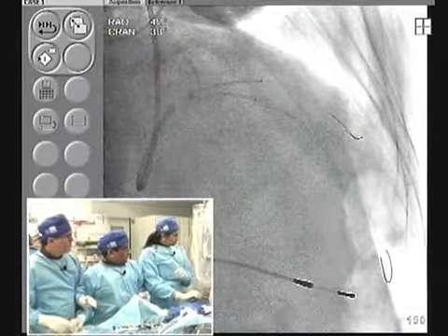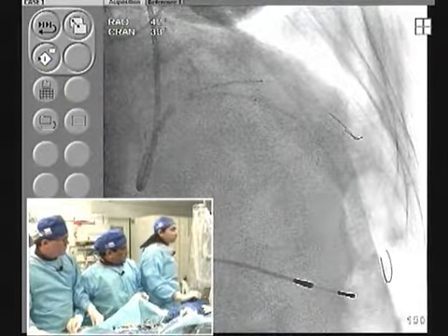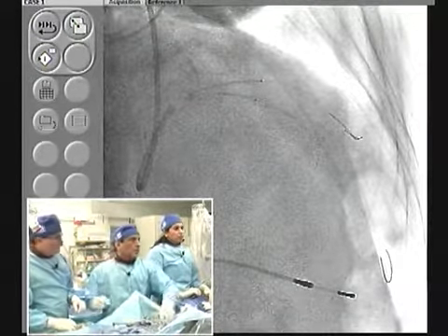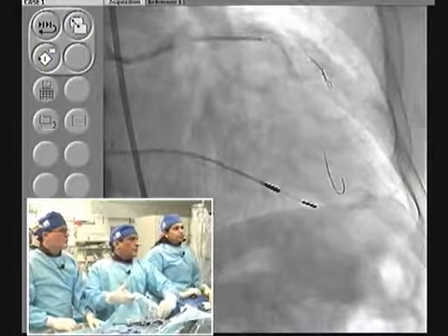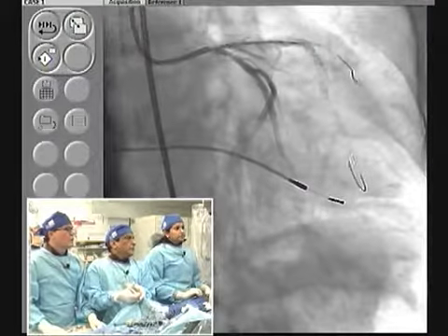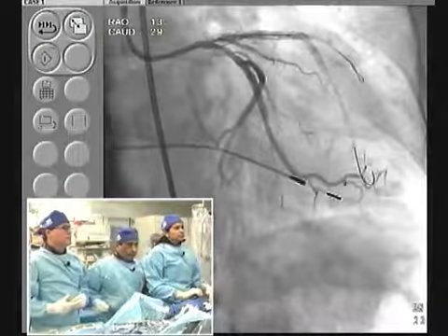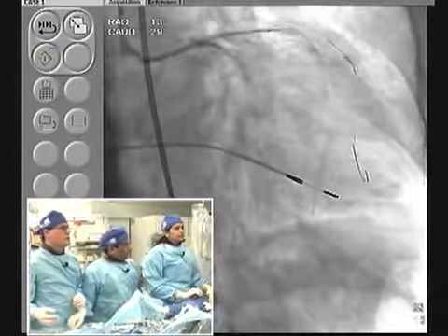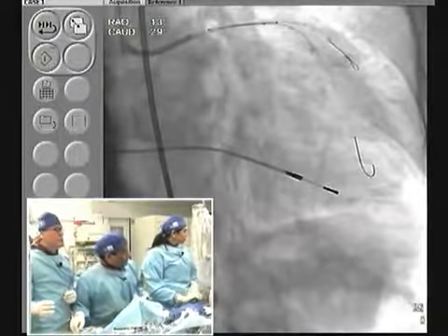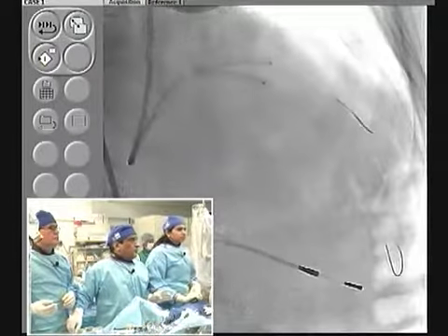Good. Something moved. Is something touching the camera? It's moving very slow. I bet it's going to be the skirting of the. Okay, good. Just 1 second. Yeah, good. They have come nicely. Remember, there was no proximal disease. We go back again and just do the same view. We check the proximal to make sure that we are not coming back into covering the circumflex. Got it. Yeah, I have not.